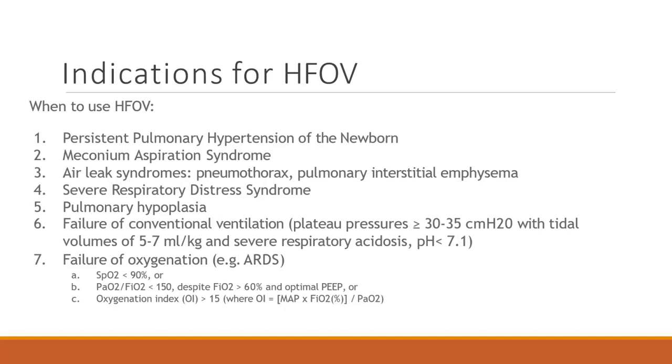And then the air leaks. Kids that are much smaller gestationally are more likely to blow pneumothoraxes. Thus, it's really important that these patients we protectively ventilate, not with the high peak pressures and the high shearing pressures that are going to destroy the lungs. So this is more of a preemptive thing. And then, of course, if they already have other issues like RDS, we're already on high settings, failure of conventional ventilation, obviously they might need to go towards the oscillator.